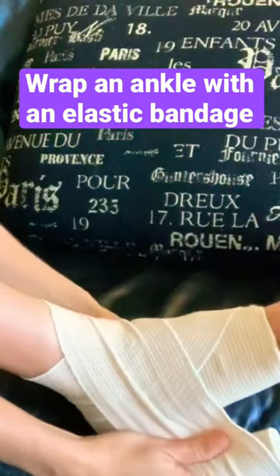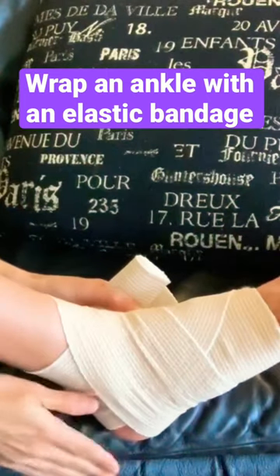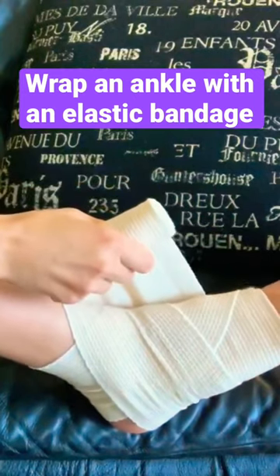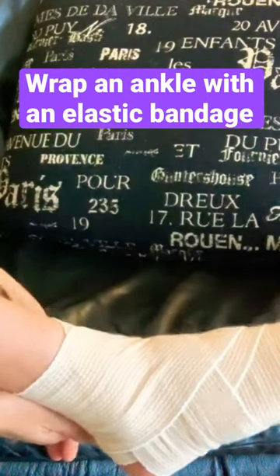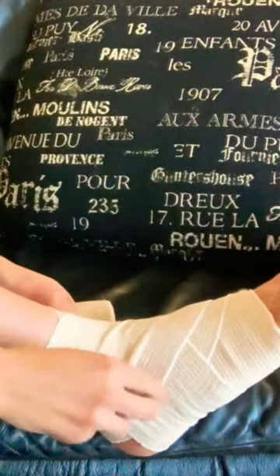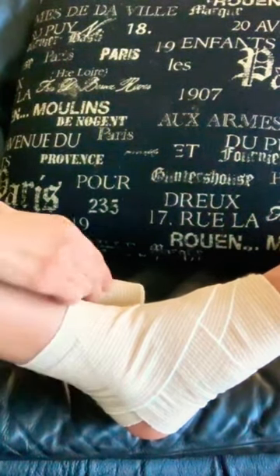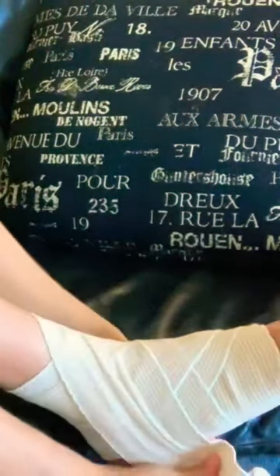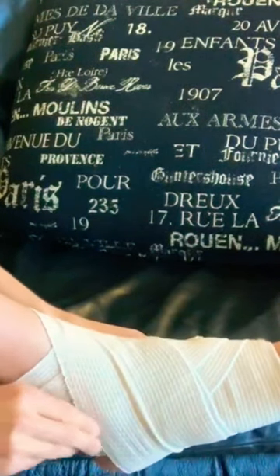In this short video, watch how to wrap an ankle with an elastic bandage using the figure-eight method. Overlap the wrap and smooth out any wrinkles as you go along. Pay special attention to cover the ankle, since that is where we want the most support. Continue to wrap downward and then upward until you reach the end of the bandage.